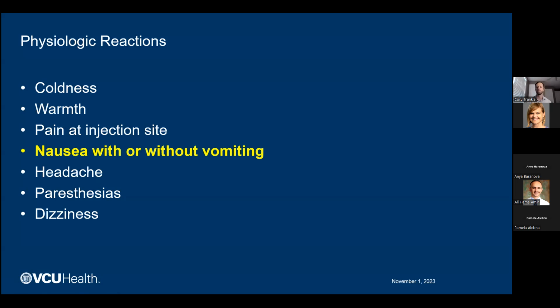They are used to this, where patients might have various side effects, including this nausea symptom, where as the contrast goes in, patients feel a sudden rush of nausea and they think they're going to throw up and might start to gag a little bit, and they might even throw up a little bit, and then it very, very quickly diminishes and doesn't last any longer than moments.